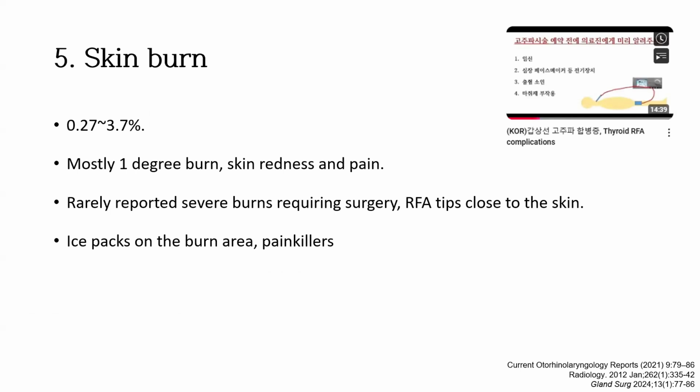She didn't want surgery to leave any scars behind. She therefore desired to use radiofrequency ablation to remove the lesion. Avoiding skin burns is the most important precaution while using radiofrequency ablation on this lesion. Her neck may be scarred as a result of the burns.